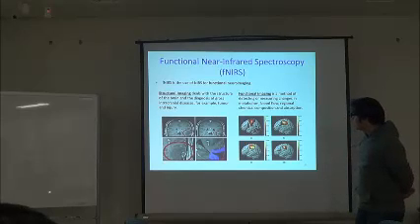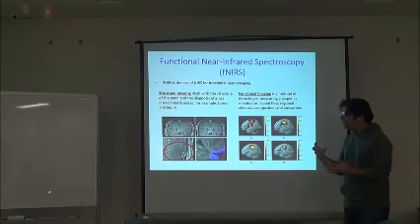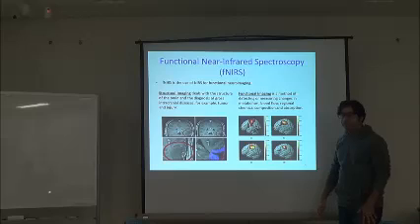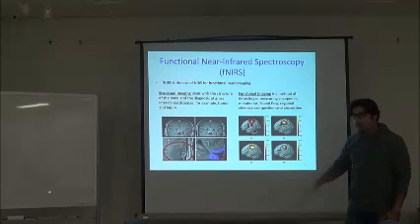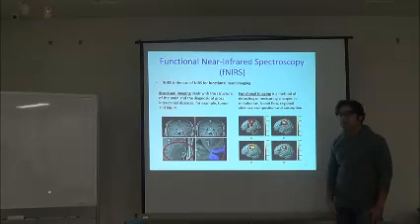Well, what we do is find out the activity due to hemoglobin, find out the T values of the activity against the non-active parts, and we usually plot the T values. Later in the statistical analysis, I will tell in detail how we plot the T values. If we say T values, we should compare with something. Yeah, that's the rest state. So we compare the activity state with the rest state.